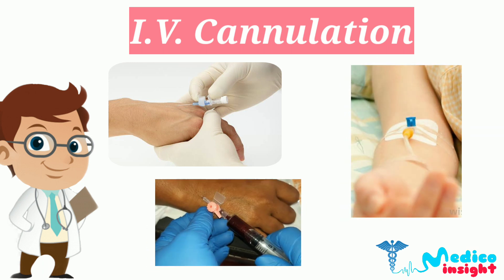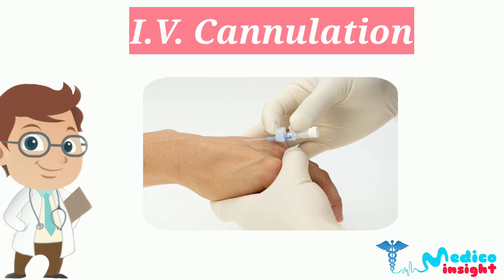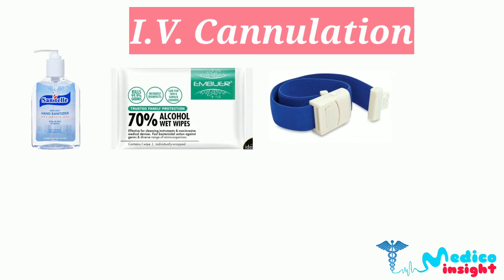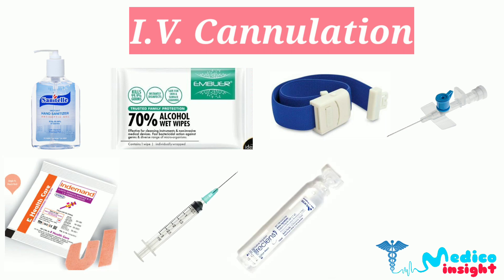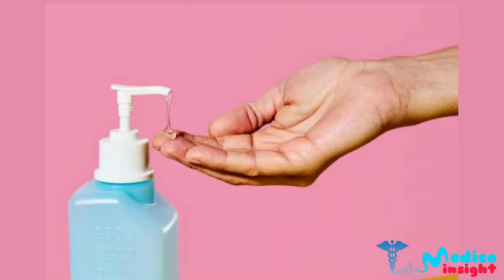For starting the procedure, you should ensure that you have all your equipment ready as follows: alcohol cleanser, alcohol wipes, tourniquet, IV cannula, suitable plaster or fixative, syringe, saline, and a clinical waste bin.